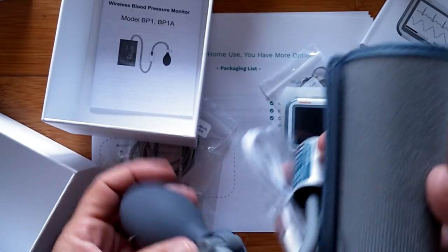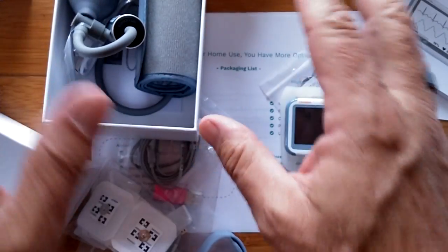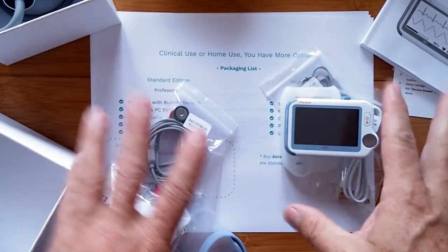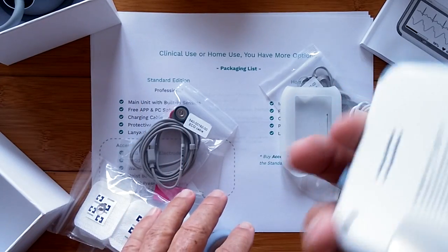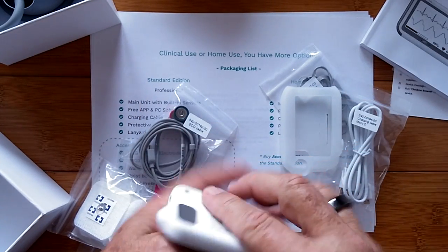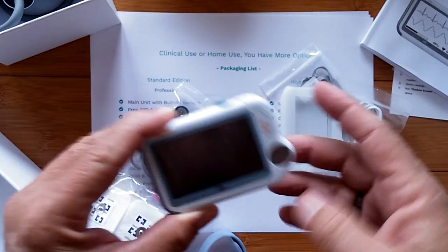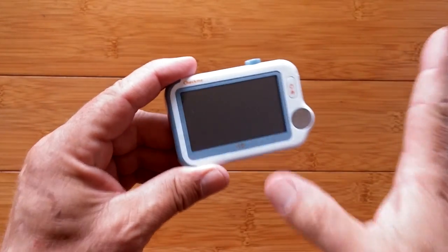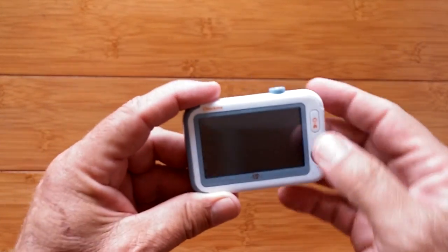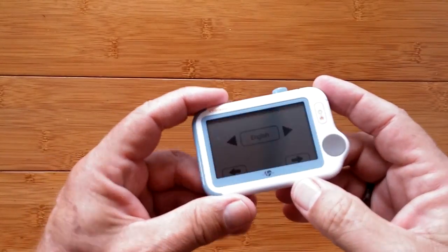Everything you see here is part of the full standard edition of the pro package of this clinical type device, but you can do a lot of individual readings directly from the unit itself. Part of why I decided to bring this in is to help you learn about technology out there that may be mission critical to where we are right now.